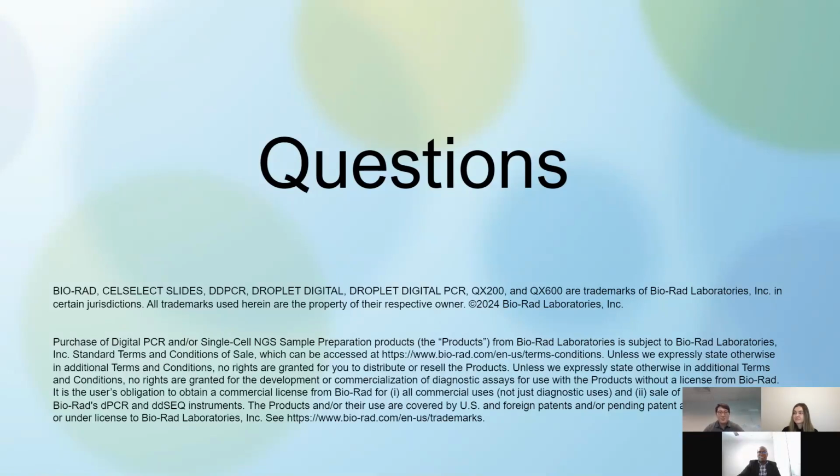And one of the slides I was presenting showed that result actually. So PBMC separation from the whole blood might cause some cell loss during pipetting and sample moving. But thankfully, using the Genesis system and the streamlined protocol we generated, we lost less than 10% of the cancer cells we spiked for this evaluation. So I would recommend practicing this pre-processing step if you haven't tried it before, so before you actually deal with your clinical sample. So that's my observation.